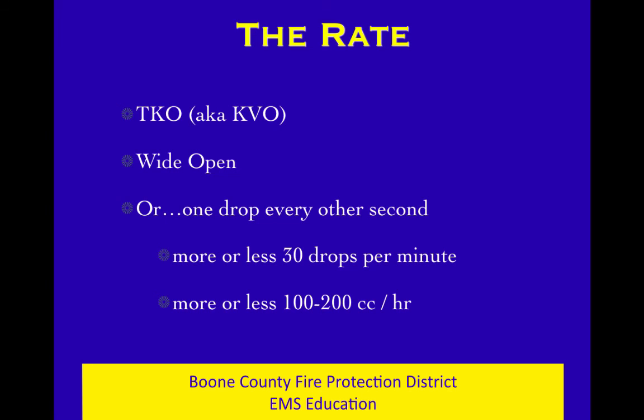But for now, if you're practicing sequence, when it says set the rate, just set it at KVO, or set it at wide open, or set it at a drop every other second or so. Basically, we have slow, really fast, and kind of medium. And that's the way we're going to deal with rates for now.